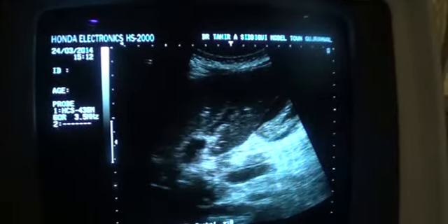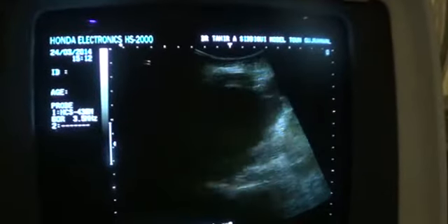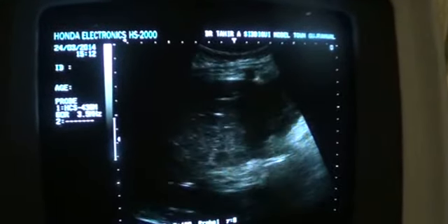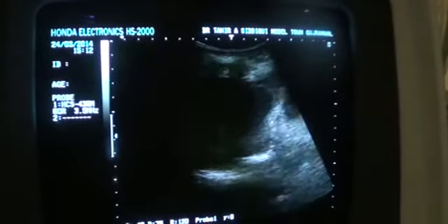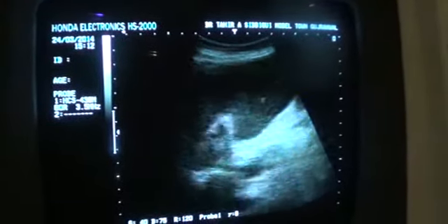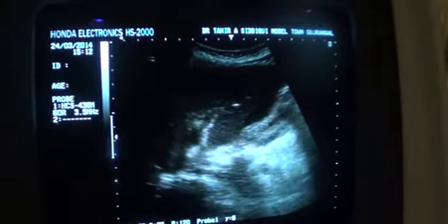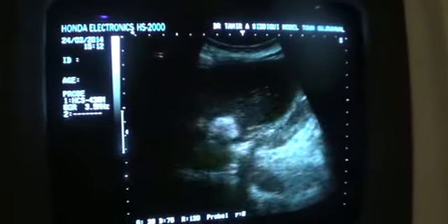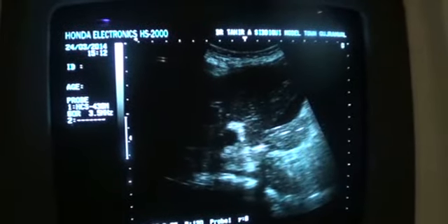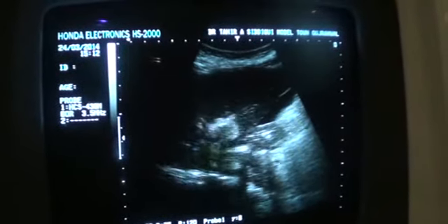Here we see the portal vein, and now you will see the stent in the CBD entering the liver. This is a broken view. Let me have a linear view.